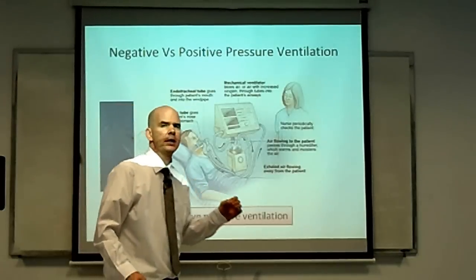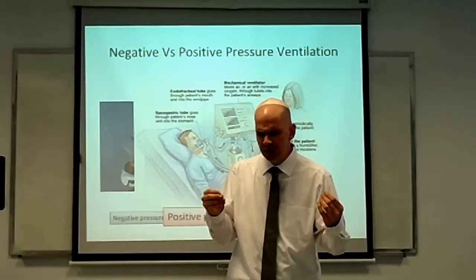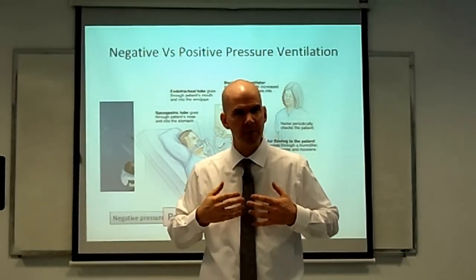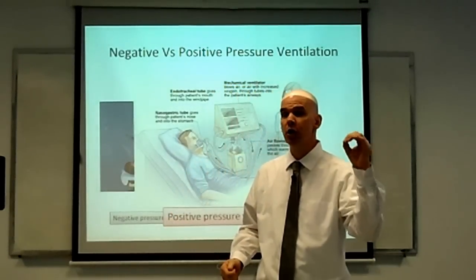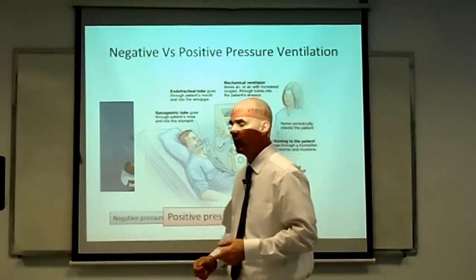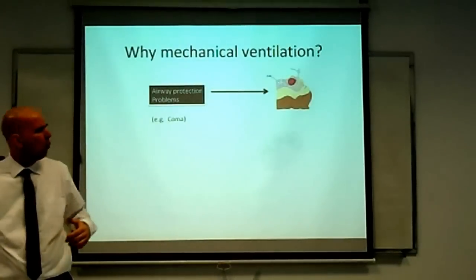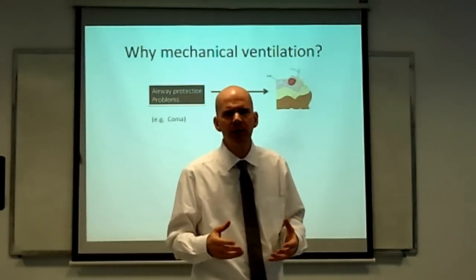But we're going to see that by violating normal physiology, by introducing a state where you have superatmospheric pressure rather than subatmospheric pressure in the lungs during inhalation, you're going to carry a number of complications. We'll look at those complications a little bit later. Now that we've established what positive pressure ventilation is, let's look at some of the indications.